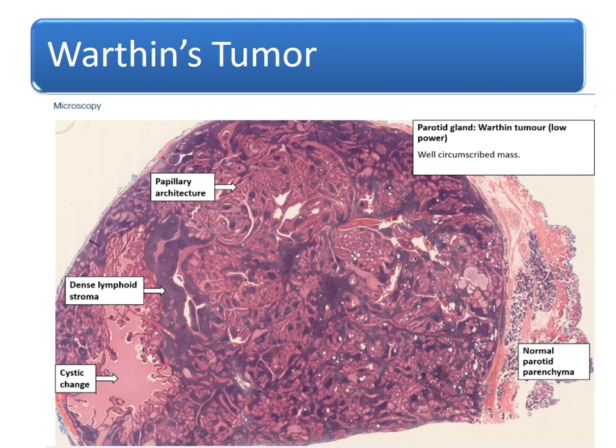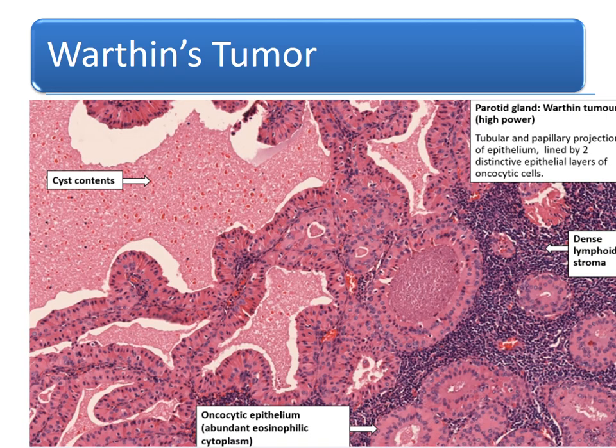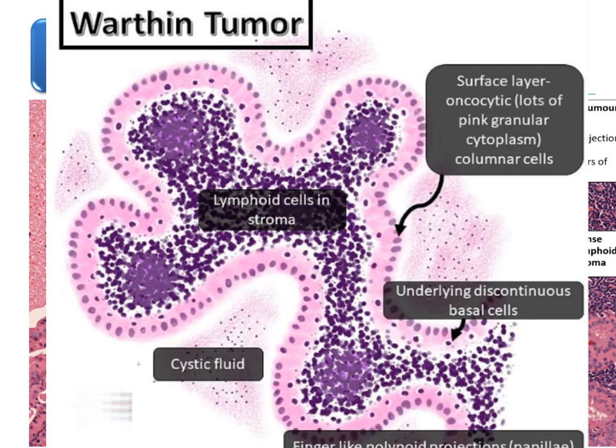Outside is normal parotid parenchyma. At closer view: cyst contents, oncocytic epithelium, abundant eosinophilic cytoplasm, and dense lymphoid stroma. Here is a clearer appearance of Warthin's tumour showing lymphoid cells in the stroma, cystic fluid, underlying discontinuous basal cells, and surface layer with pink granular cytoplasm of columnar cells.